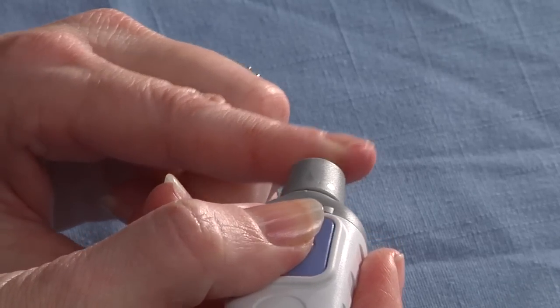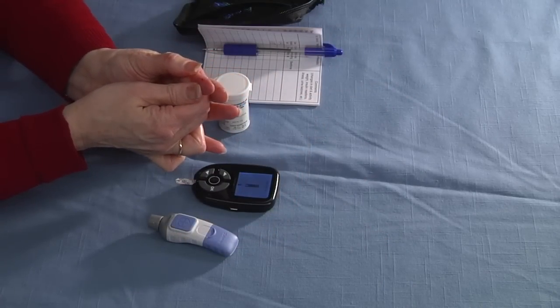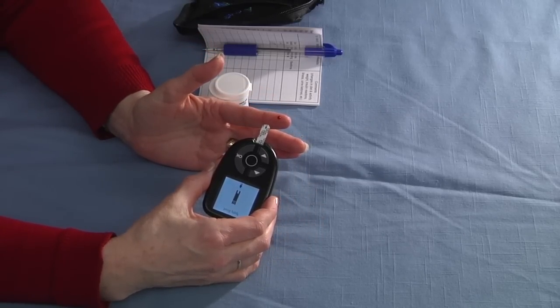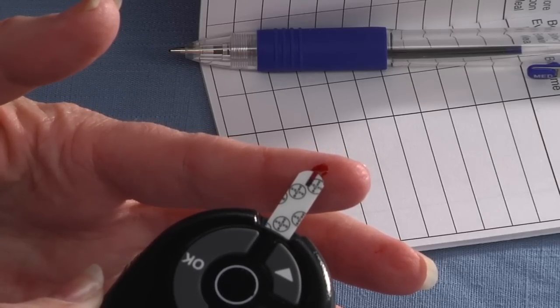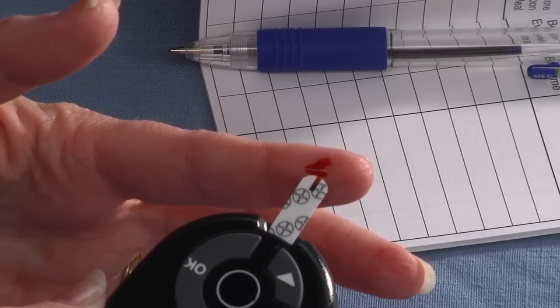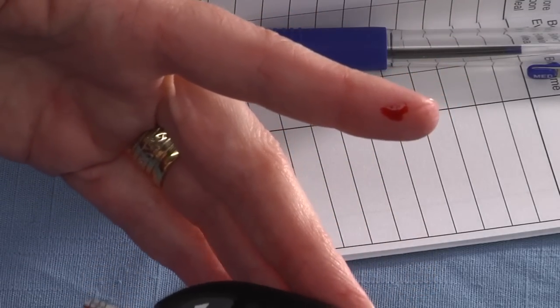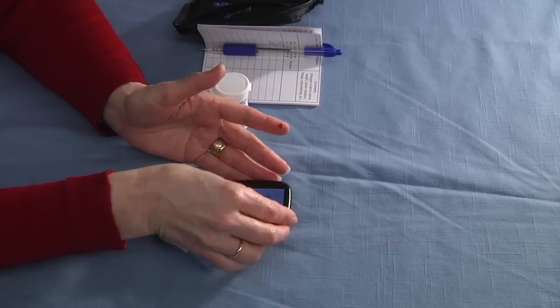If you don't see blood right away, simply milk your finger to get an adequate sample. Once you have a good sample of blood, simply touch the strip against it and it will draw it into the strip. Now I have about five seconds and it's going to give me a reading.